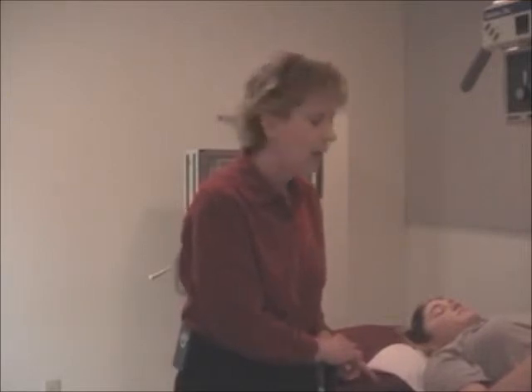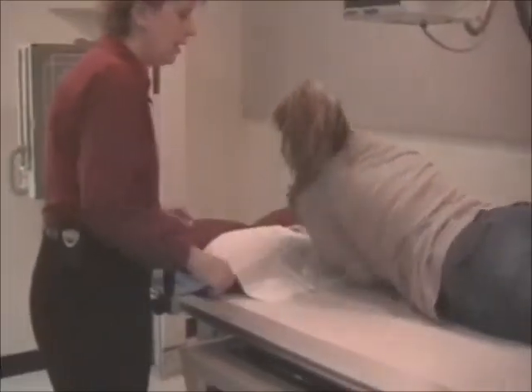The doctors will evaluate every radiograph after you take it, and then they will give you an indication of when to take the next one. So we're going to pretend that this one's our 15-minute follow-through. And we're going to have our patient be onto her stomach.